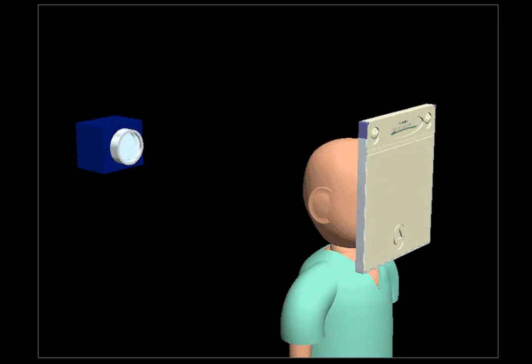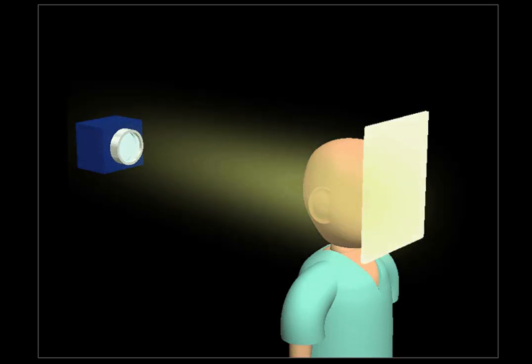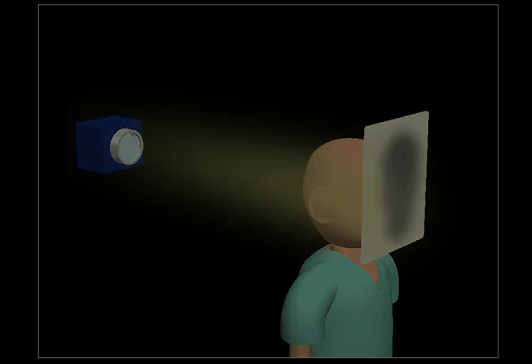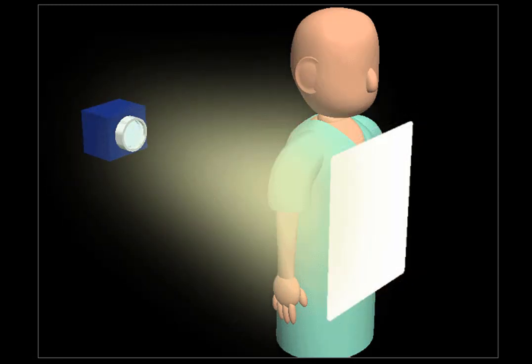Now let's see how to take X-rays in detail using a routine example. As we've seen, you must use a cassette. And this is how it goes. First we do the head. Then we do the chest.